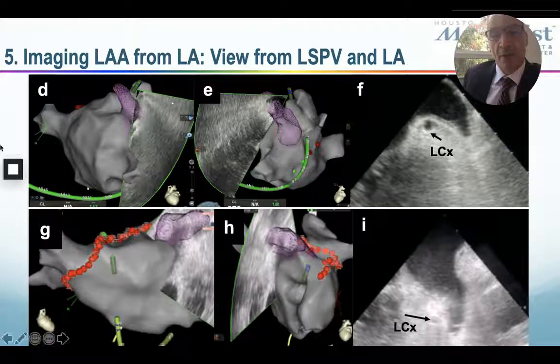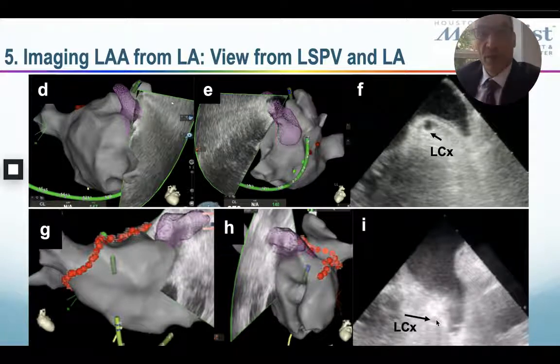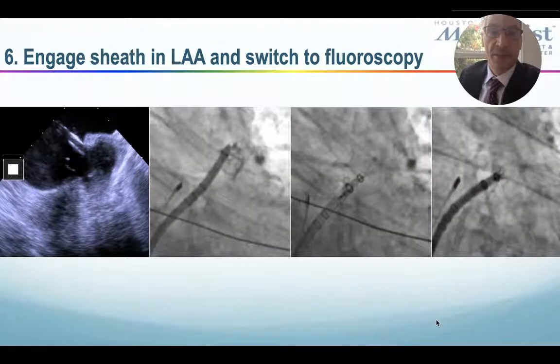A simpler, but perhaps less stable view is from the left atrial body. You park the transducer in the left atrial body and aim anteriorly, and you will see the tip of the ridge and the appendage, as well as the circumflex in some cases. So these are the most commonly used views to see the left atrial appendage from the left atrium using ICE.